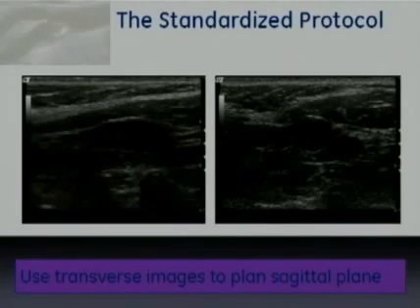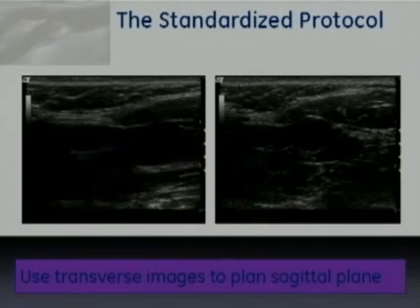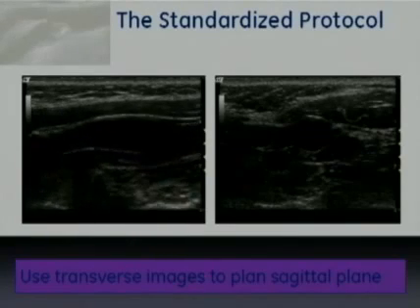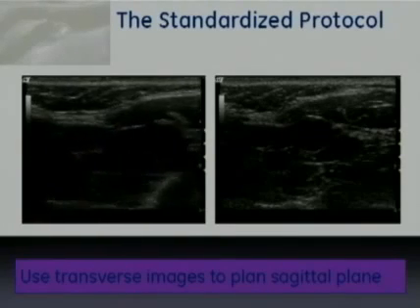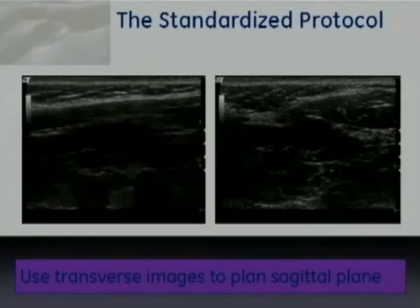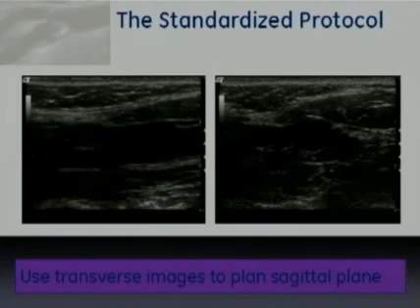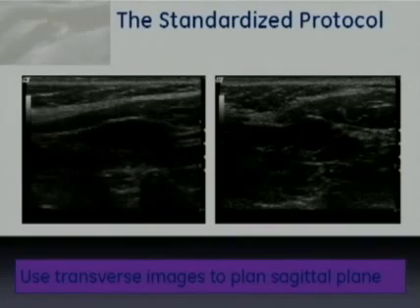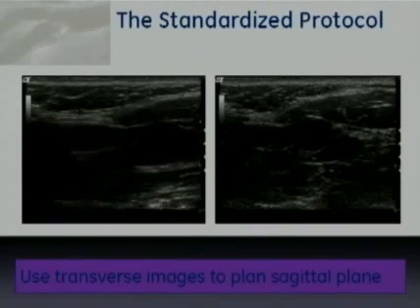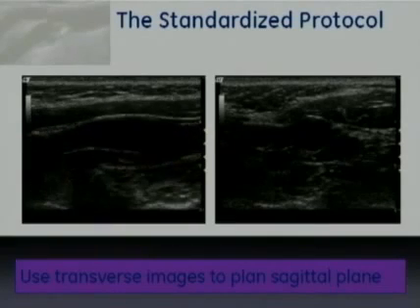This isn't a large motion, it's a very tiny motion because these vessels are actually quite close together, just going back and forth, and then making sure that each one of them ties back to the common carotid artery. Why is this important? Because it ensures that we're looking at two different vessels rather than one vessel from two different views. Which is a mistake we might make if we pick up the probe and simply move it between the vessels. It's easy to actually look at the same vessel and mislabel it as two different vessels. So this will keep you from making that mistake.